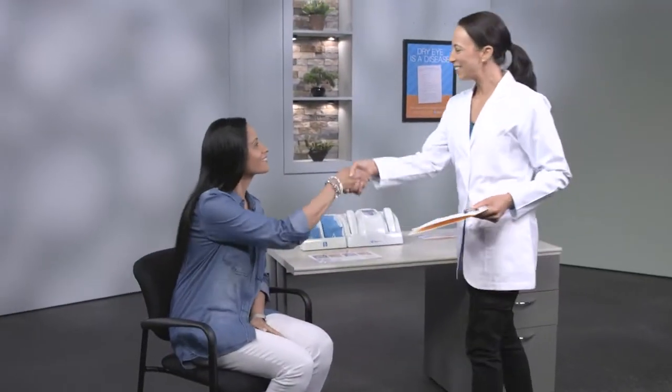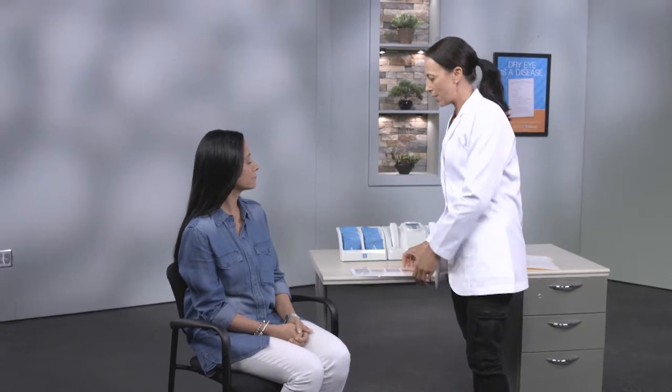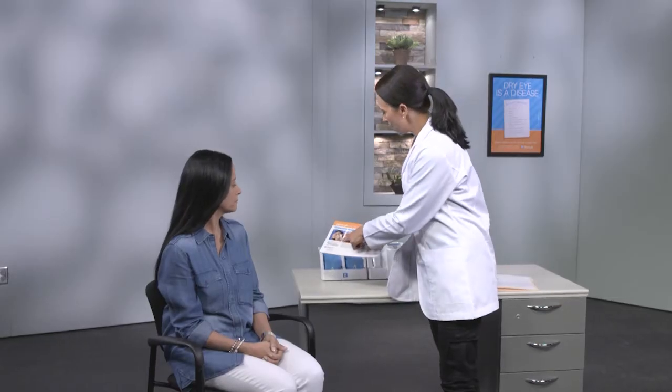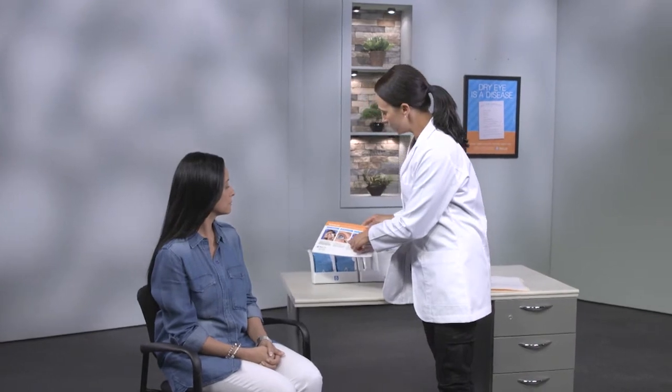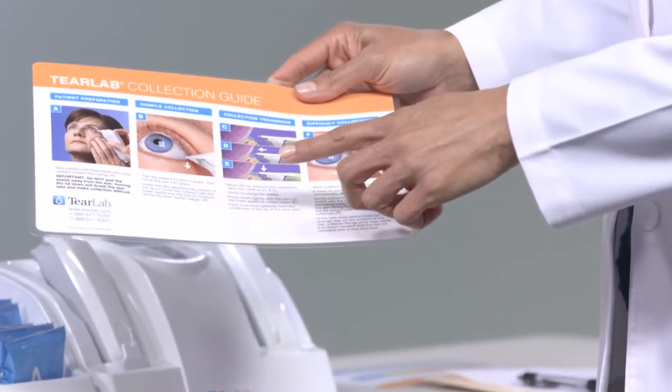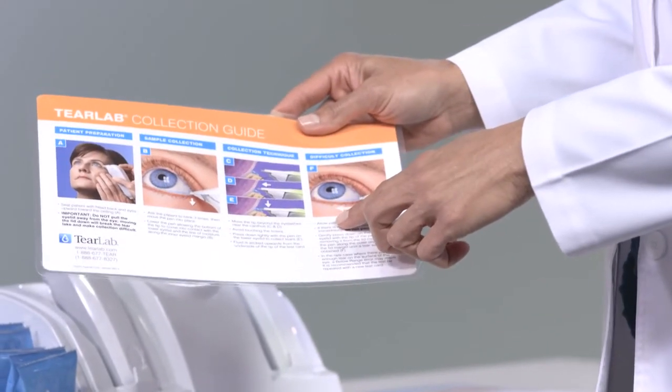The TearLab Diagnostic Test offers an objective, quantitative test for diagnosing and managing the ocular surface. The TearLab test requires only 50 nanoliters of tear film and provides a quantitative assessment of tear film health in less than 30 seconds. The test is fast, easy and accurate and can be performed by both doctors and technicians.